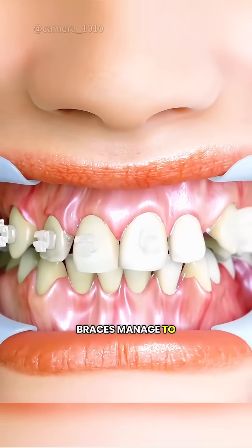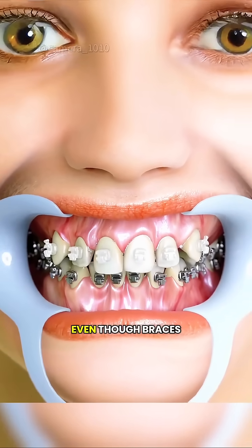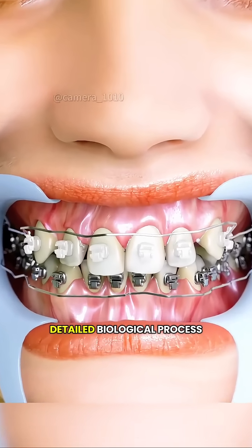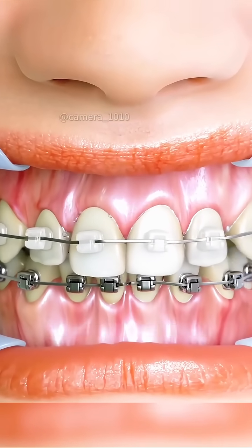Have you ever wondered how metal braces manage to move your teeth little by little? Even though braces just look like brackets and a metal wire, they're actually driving a slow and detailed biological process inside your mouth.